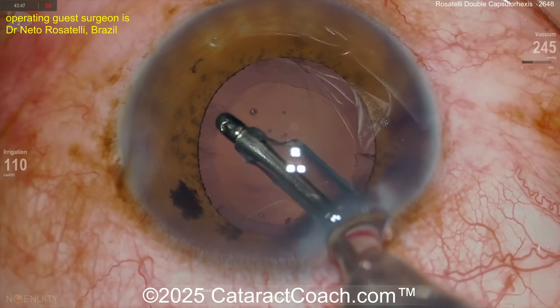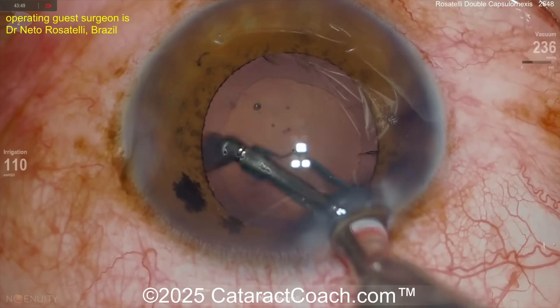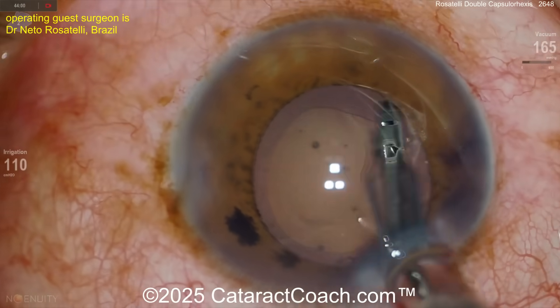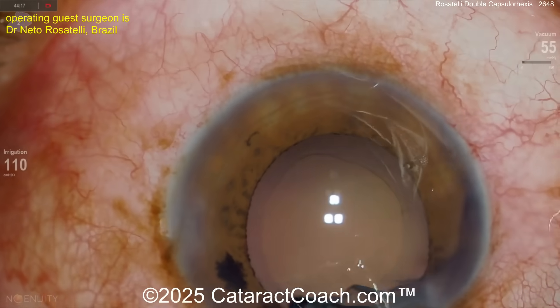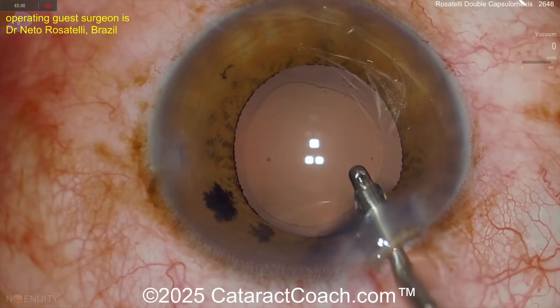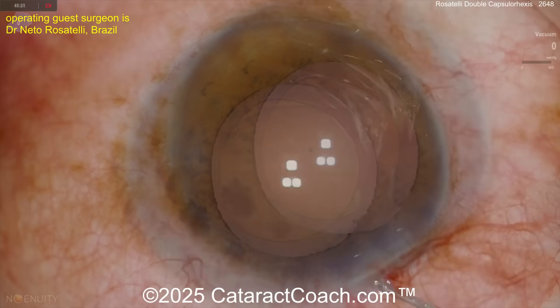This patient is going to be so happy. Can you imagine coming in with a white cataract, seeing almost nothing, and having this beautiful elegant surgery done — and then having essentially normal vision in just a few minutes? That is just — I just love white cataracts. I could never get sick of them.